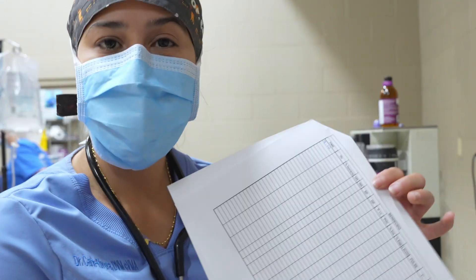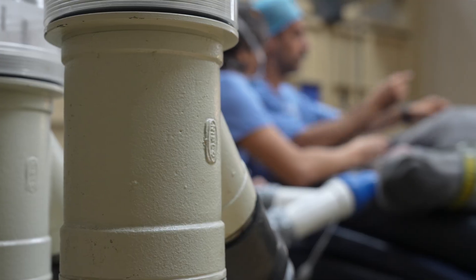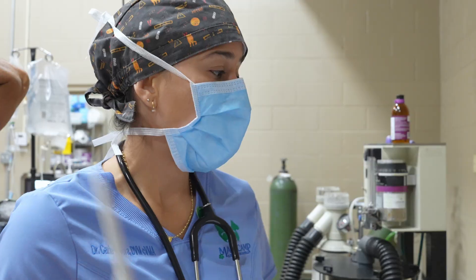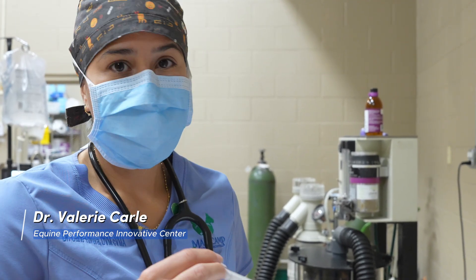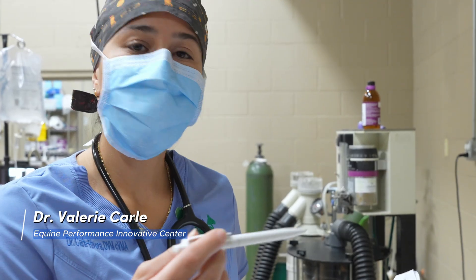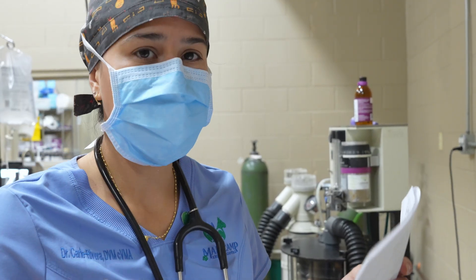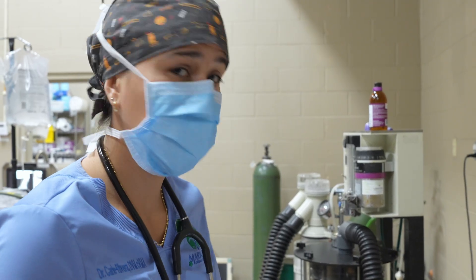This is the anesthesia monitoring sheet. It's really important for us to know the heart rate of the patient, the respiration rate, the oxygenation, and how much anesthesia they're receiving. This is all part of the medical record, and it helps us know if the patient is in a good induction stage or if we need to increase or decrease sedation. It's a good monitoring tool — you do it every five minutes.